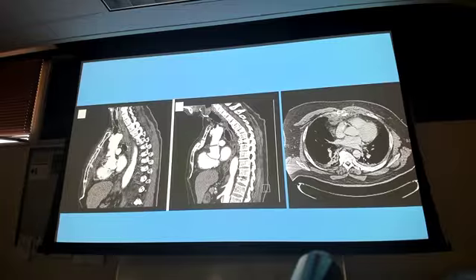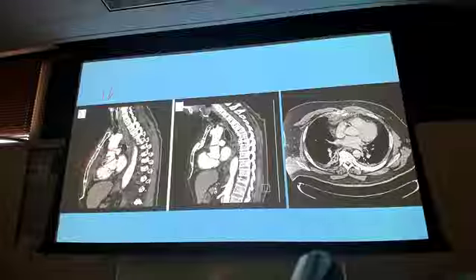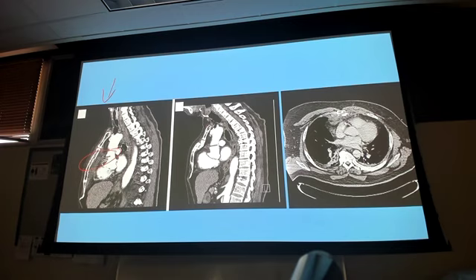It's a different patient. But when I look right here, I've got that break in the cortex, and we're going to go over the cortices and how to read the x-ray in a later lecture once we get through the intro stuff. But that break in the cortex. Now, there is no way I am seeing that on an x-ray. There's just not. It's on the posterior aspect of the sternum. This particular one, the sternum is not shifted, it's not displaced or anything. That's a minute fracture. I wouldn't see that.